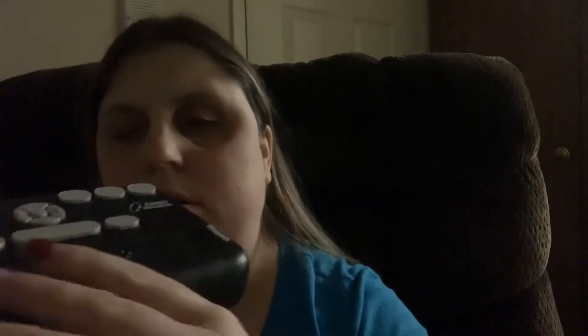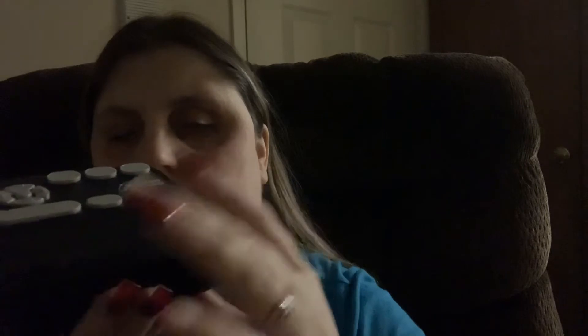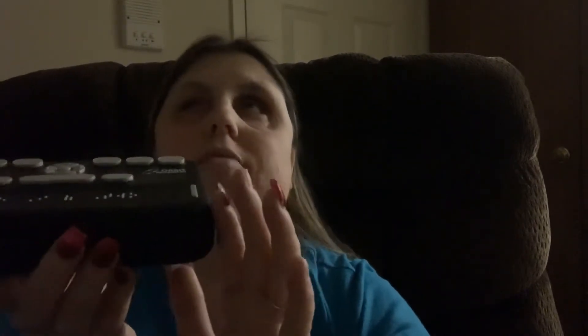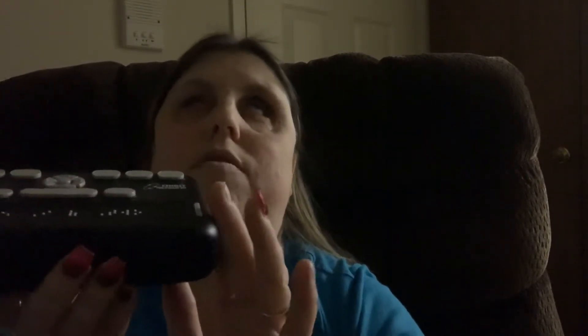That says Max Lucado. That says volume one of two. Whatever you have loaded, or whatever you're on on your iPhone, it takes that text and converts it into Braille down here. It's not a computer.